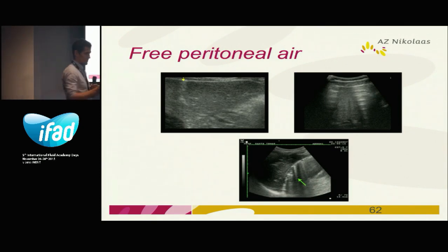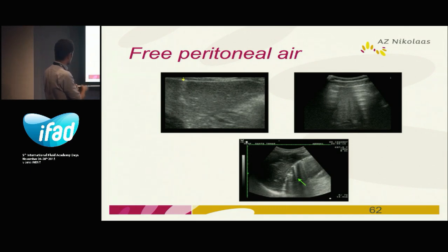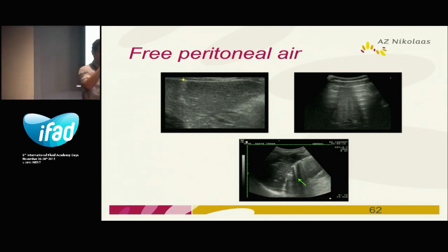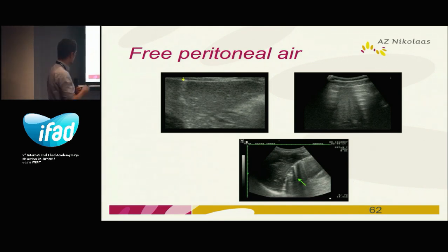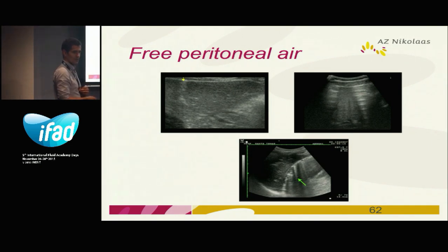This is very important — with ultrasound, which I think we're not always aware of and don't use often enough, we can perfectly diagnose free air. This is the liver, and if you see hyperechoic lesions on top of the liver, we know it's free air. Very importantly, stones have a very clear shadow, but air has a very dirty shadow — it shatters and moves up and down. Here again, on top of the liver we see air. This was a patient with perforation of a gastric ulcer, and here we have free air between the liver and the stomach.